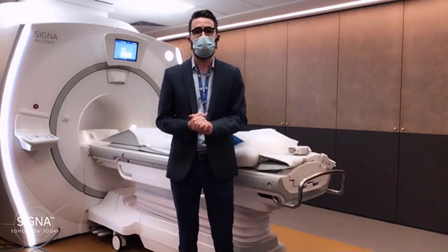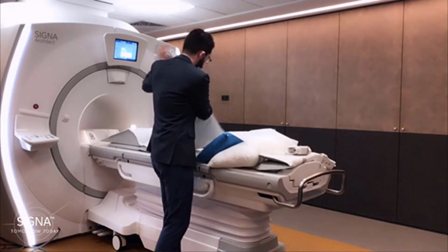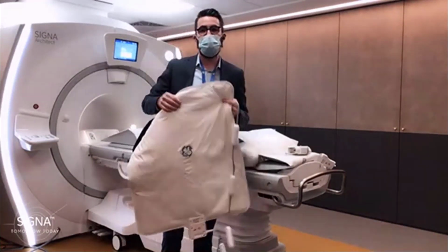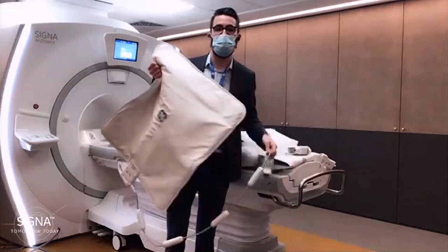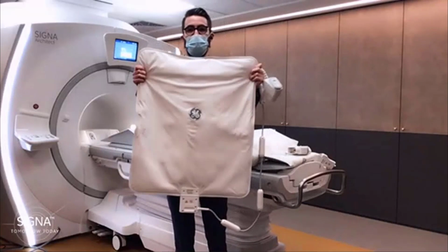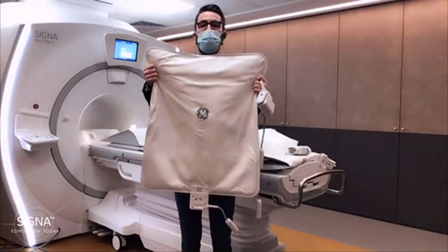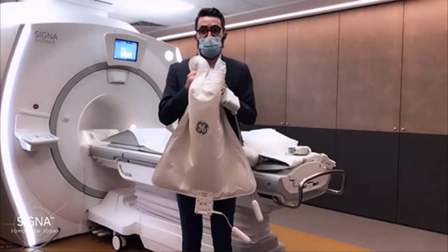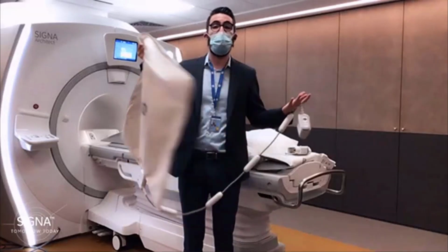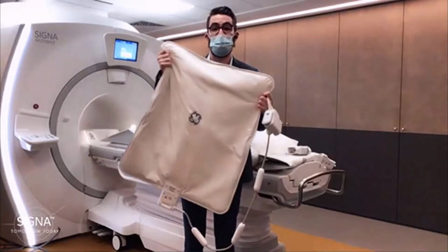But just before we start our scanning session, and as all MR acquisitions and examinations start with a great coil, I want to first present the coil we are going to use this morning during this session. I think you probably know it. This is the 30-channel anterior array air coil. It has a lot of characteristics. First of all, the weight of the coil is really light. It's 2 kilograms with cables and everything.